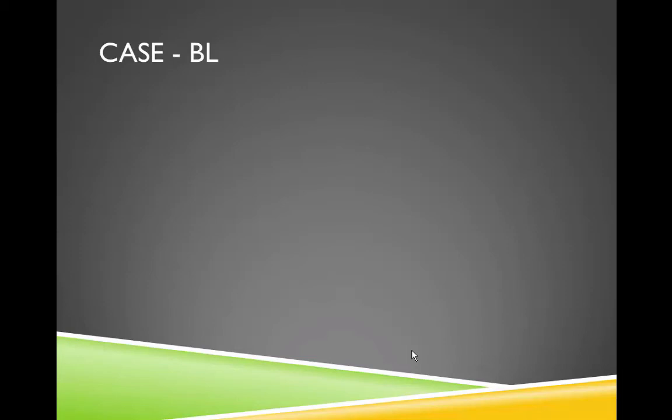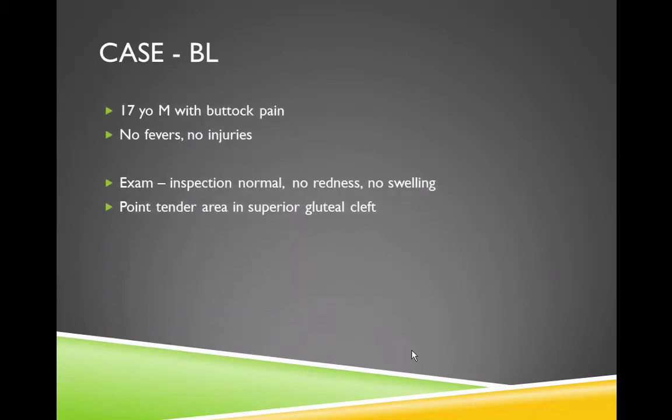And so just for fun, I want to give you one more quick case of a soft tissue infection. So this is a 17-year-old male, a young man. He's got buttock pain. He doesn't have any fevers or injuries, it just hurts right at the superior gluteal cleft. No real good reason for it.